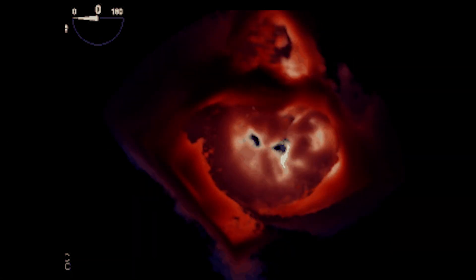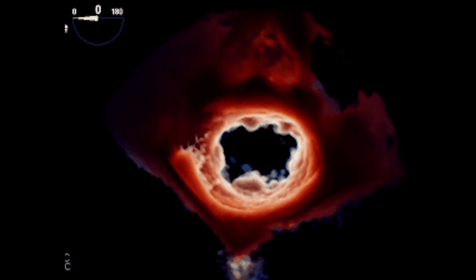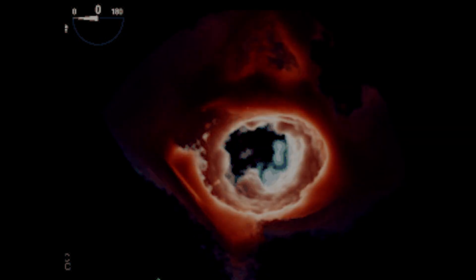Remember, what we are looking at is a 2D slice through a three-dimensional structure. In this 3D echo, you can really see the gap where blood would be leaking back through. On 2D imaging, we can't always visualise that gap, but we can see from where the colour jet is arising and describe that location.